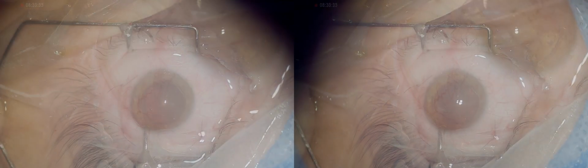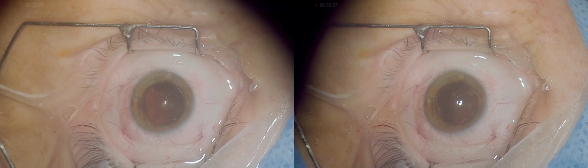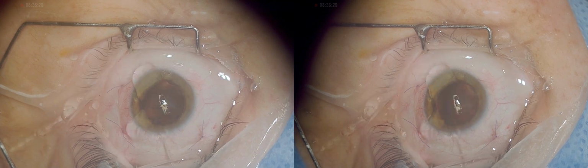A stitch is put crossing the conjunctiva just in case. I appreciate your attention.